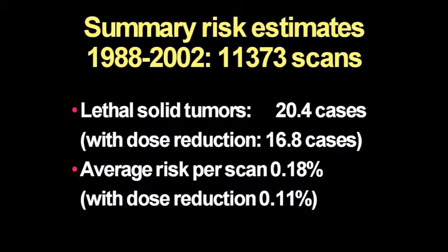We didn't really know what these patients were getting. We just added the dose as we knew it at the time. And that is the flaw of this way of thinking. It is not an observed variable, it's just a model, it's an estimate. That's what we have to realize.